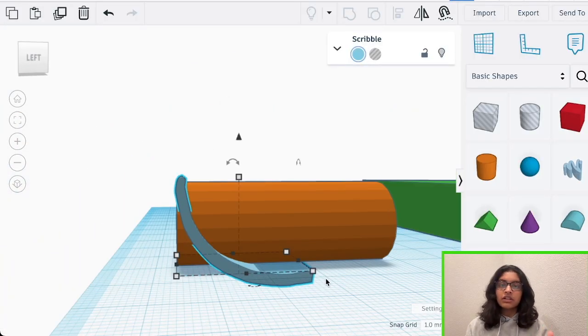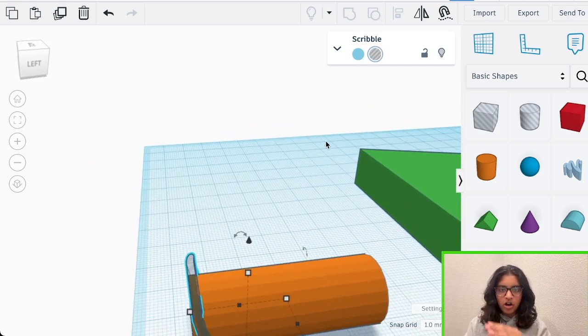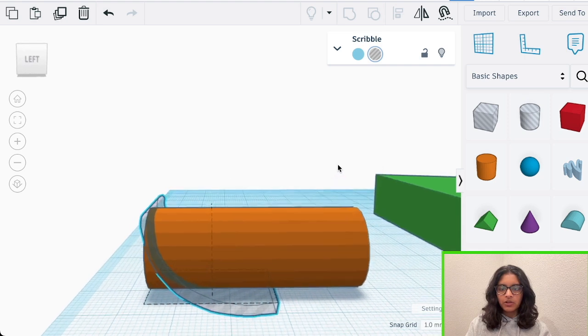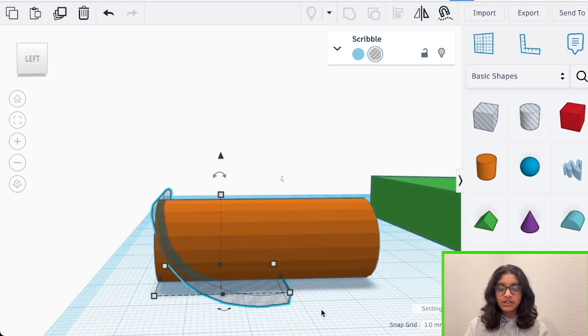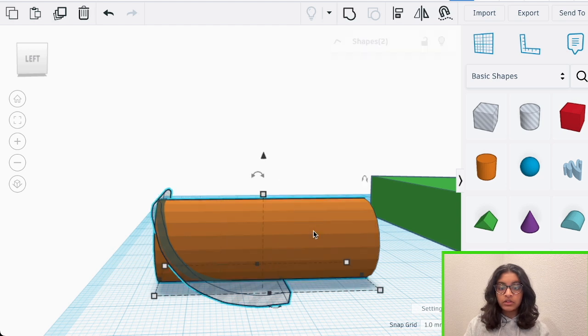Alright, so this curve is looking pretty spot on to me, so I'm going to make it into a whole object. So it's just going to curve and carve out that part of my finger. And then I'm just going to group both of these objects together by clicking Shift and holding it down and then clicking on the two objects I want to group. The grouping tool is up here in the top right corner.